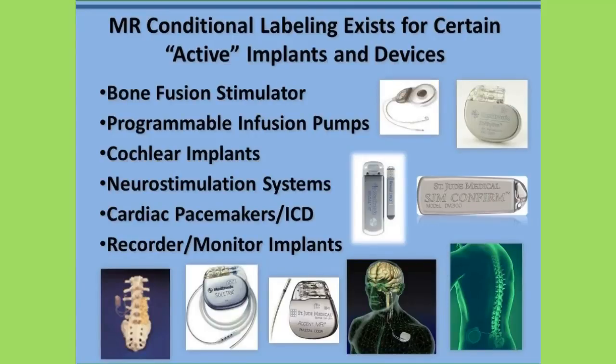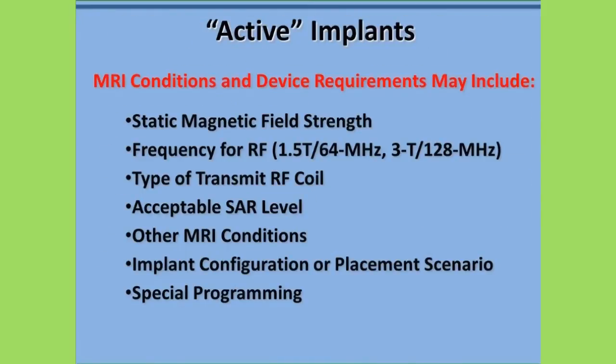Please be advised that the availability of the active implants with MR conditional labeling varies depending on geographical considerations, so that not all of these devices are currently available in the United States. With regard to active implants, in each case, what you'll see is highly specific conditions that must be followed in order to ensure that MRI examinations are performed without hazards in patients with these active implants that have the MR conditional labeling.